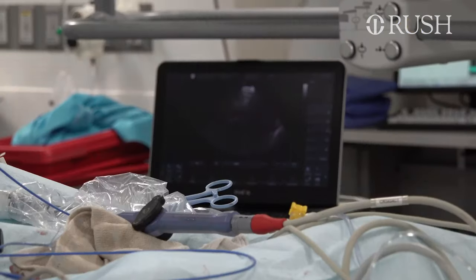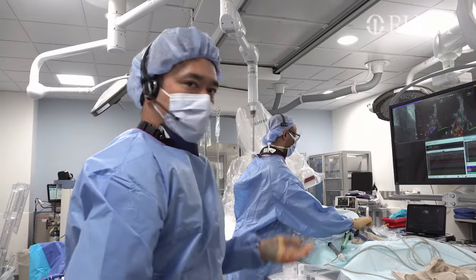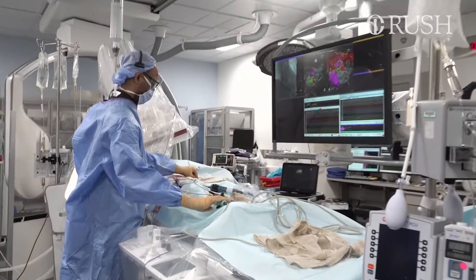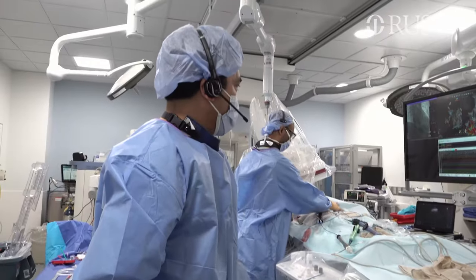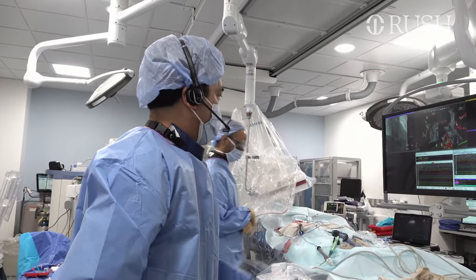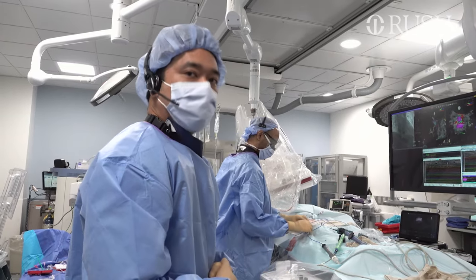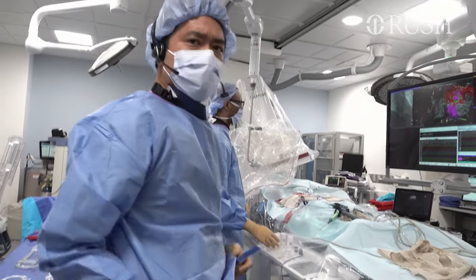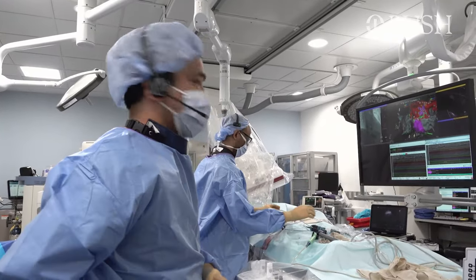Jamar will just check to make sure that there's not any fluid around the heart, that everything looks good structurally. Everything will come out of the body. We'll reverse the blood thinner. We'll hold pressure here for 10 minutes after he's done that. We'll wake up Thurston and get him to the recovery area. Easy as that. It took a little bit less than 2 hours to do, beginning to end. We did a good amount of work. He'll do well.